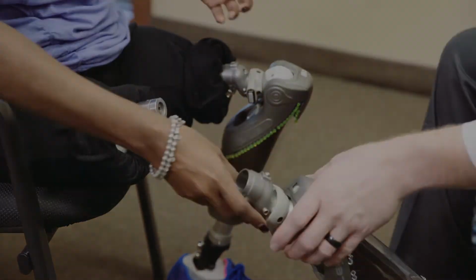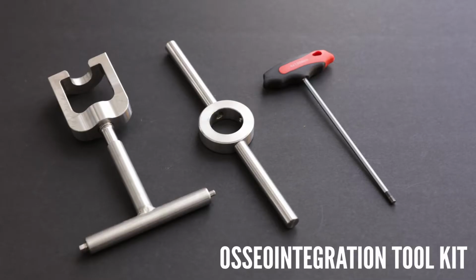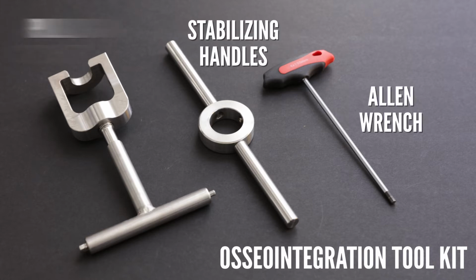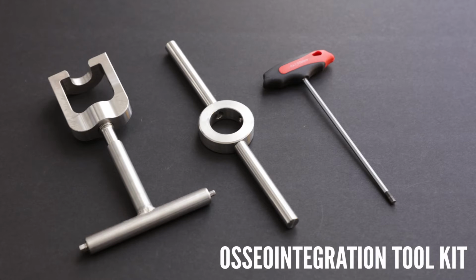It is important to mark the alignment of the components before removing them to preserve the overall rotation of your prosthesis. To remove the prosthetic components only requires your standard Allen screw, but to remove the bushing and taper sleeve requires special tools provided by the Osseointegration Group of Australia. These tools allow the patient to stabilize the implant and femur as you apply torque to the locking screws.